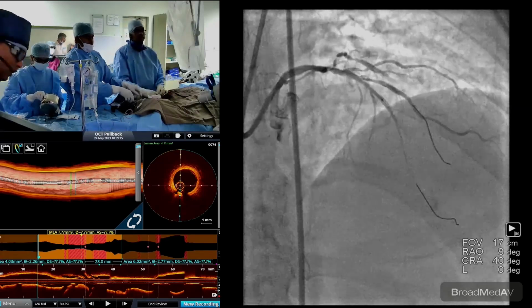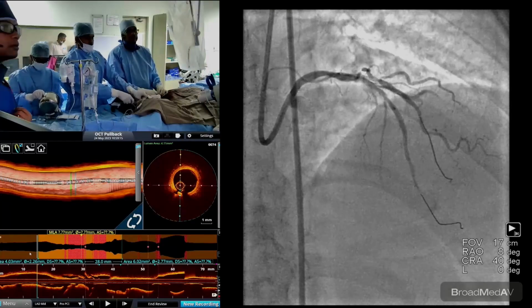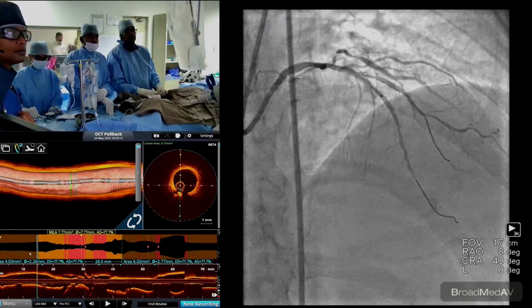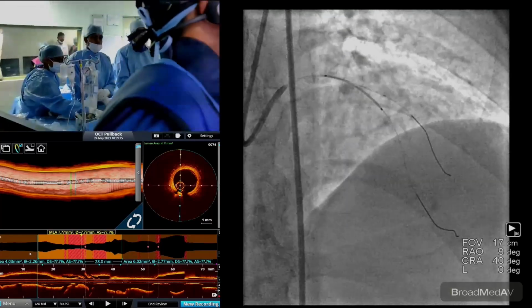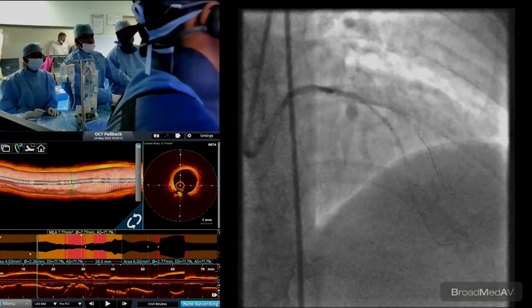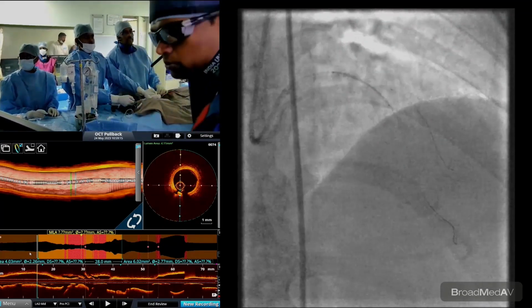What do you think? No, I think we need to go in a little bit. I'm a little worried that there's a proximal plaque. We may miss that. You see, there's a proximal plaque. What we have seen is from this bulge up to this portion. So you want to go down a bit. Take care. If at all required, we will do OCT, then cover with one more small stent above.